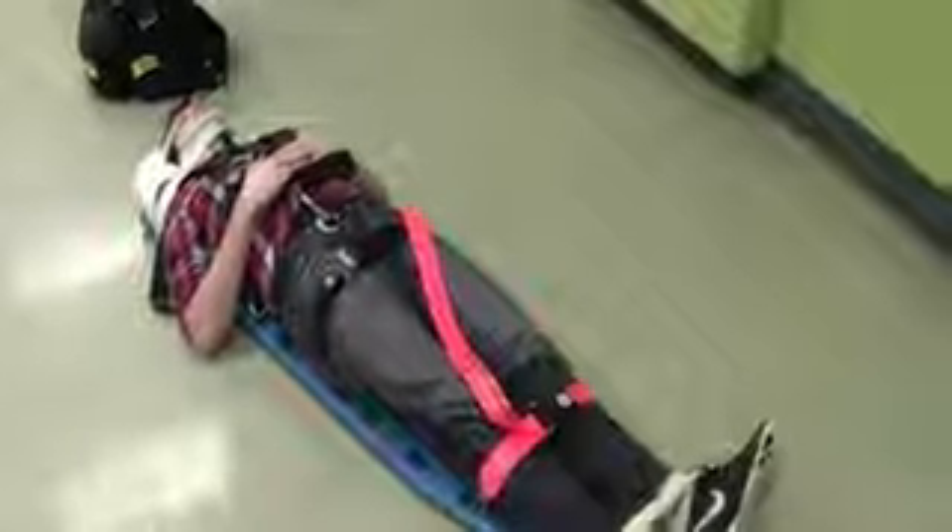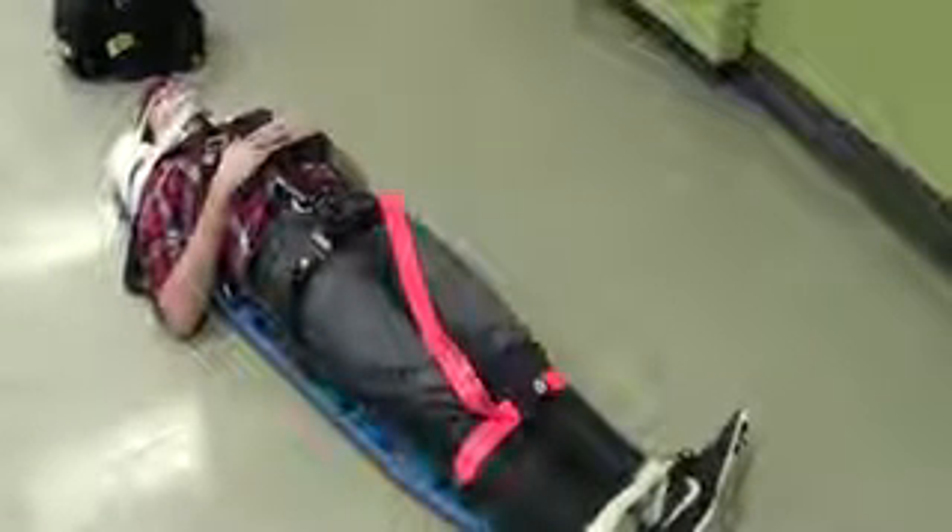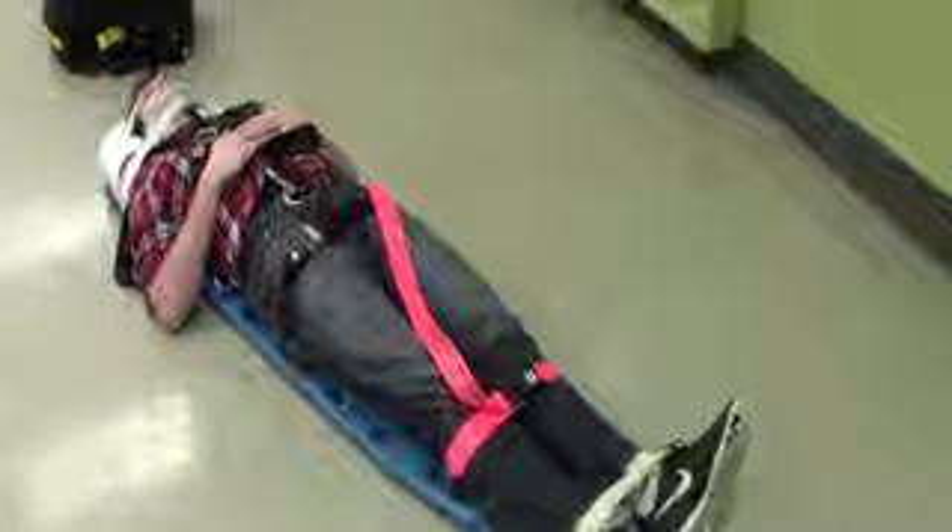So now the patient is fully immobilized and ready for transport to the hospital to be further assessed by a physician.